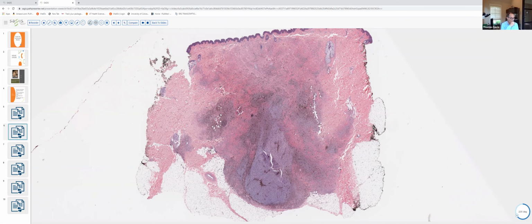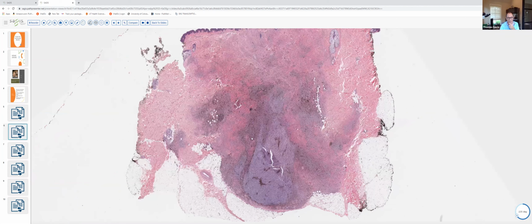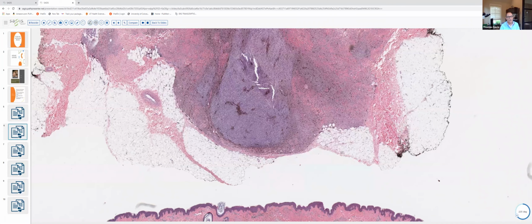They are, again, confined to the dermis, but typically a cellular blue nevus, as this one, will fill the reticular dermis, often with deep extension of these bulging nodules into the subcutaneous tissue. And these bulging nodules frequently have a dumbbell configuration, but in a cellular blue nevus, they're always going to be sharply marginated at the base. So you can have these big dumbbell configurations, but they won't typically infiltrate into the fat. They tend to be sharply marginated.